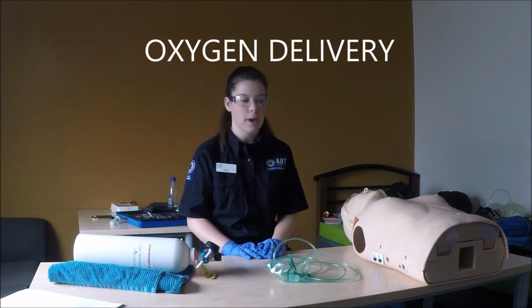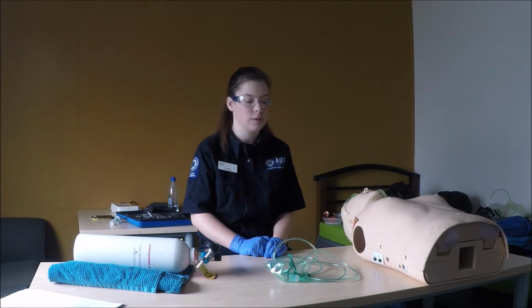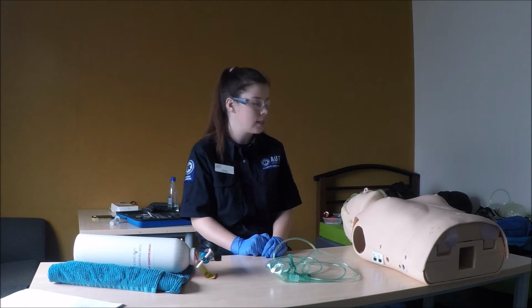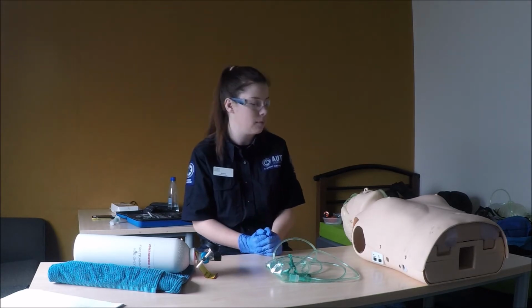Right, so we have a patient here that we would like to give oxygen to. Indications for giving oxygen include decreased GCS, respiratory distress or shortness of breath, shock, traumatic brain injury, smoke inhalation, saturations below 94%, and clinical judgment is a good indication for whether you think that a patient should get oxygen.